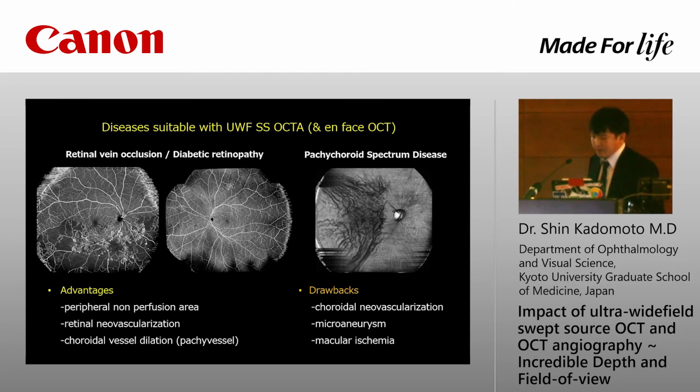On the other hand, there are some drawbacks. Ultra-widefield OCTA is not suitable for evaluating the choroidal neovascularization, known as CNV, or microaneurysms or macular ischemia, because the lateral resolution of ultra-widefield OCTA is not sufficient for these lesions.